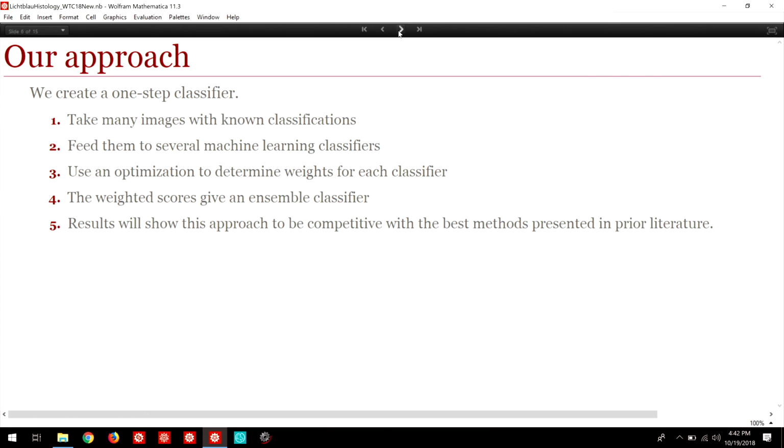But this year I tried ResNet. By the way, this result was not even published. With ResNet 50, so transfer learning and fine tuning, the result moved even to 95%, which was, of course, very, very nice.